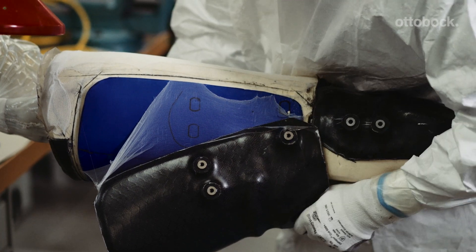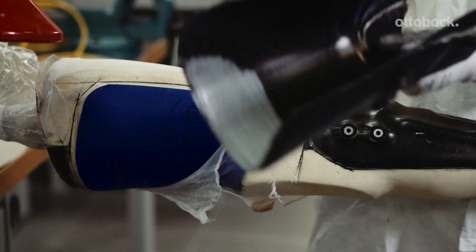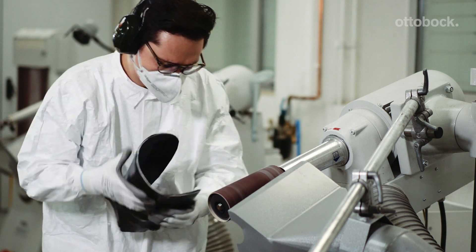Remove the orthosis shells from the model. Sand the orthosis shells according to the shape of the trim lines.